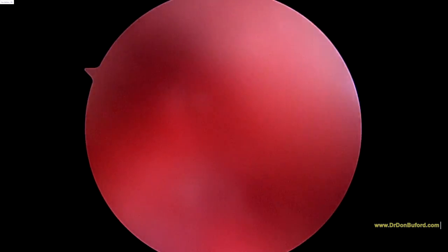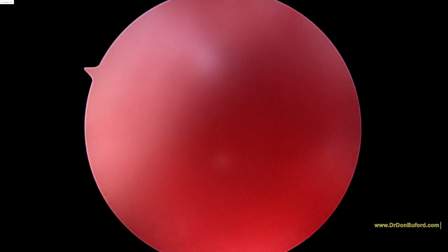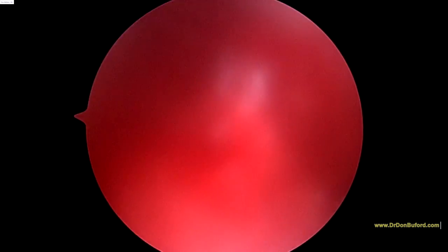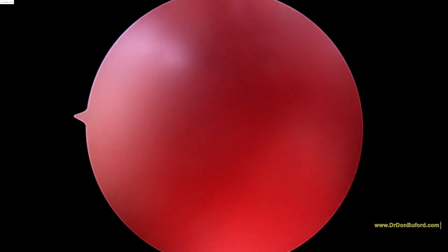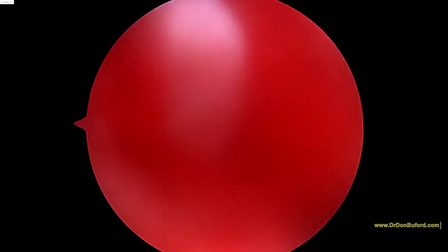So we're done here. I've got the water off on purpose so the picture's not going to be great, but you can kind of see how the whole notch is filled with this bone marrow concentrate that has the stem cells in it. We've gotten into the ACL at least six times — in the middle, bottom, and top, probably a little bit more than that. And we put in a total of, I think, three cc's into the ACL.